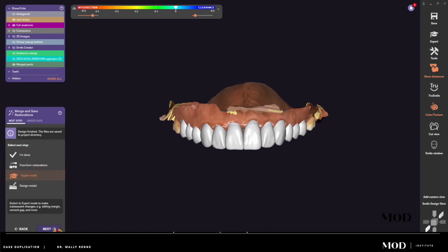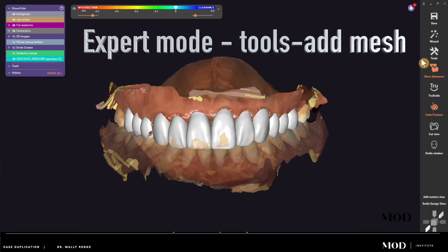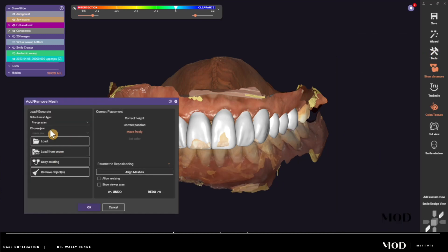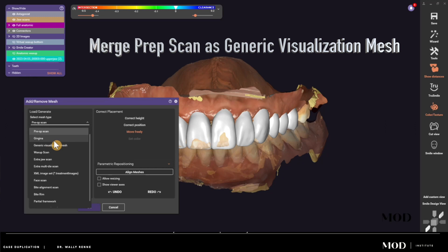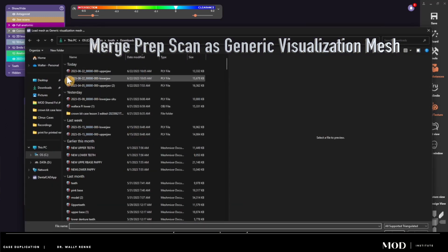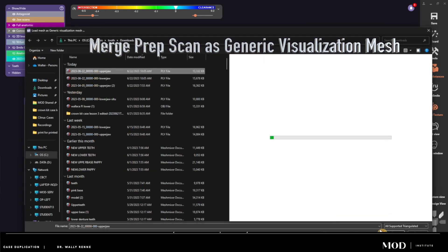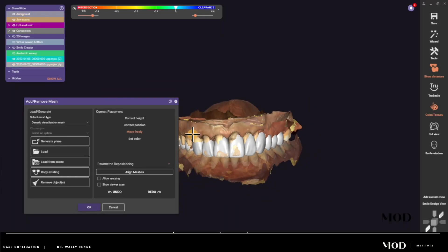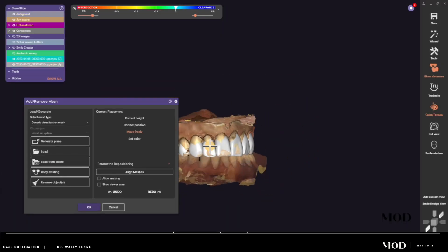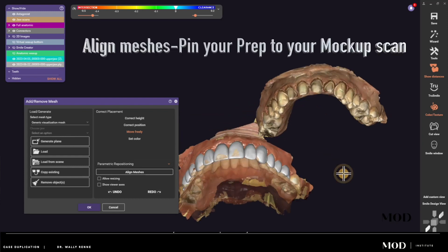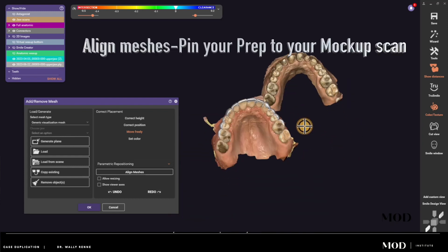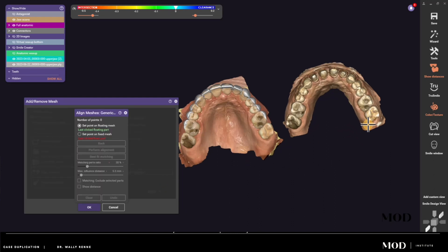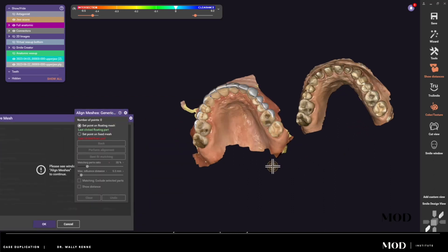Now we are on the day of tooth preparation. What I did was take the original file where I did my mock-up and I'm now adding models to the case of the final preparations on prep day. Here we are pinning my prep model to my pre-op model that I already did the wax-up on, so here are the tooth preparations. In Exocad we're going to do an align model with best-fit matching.